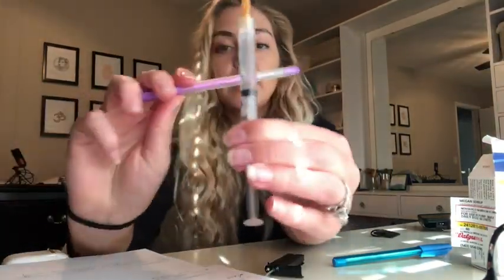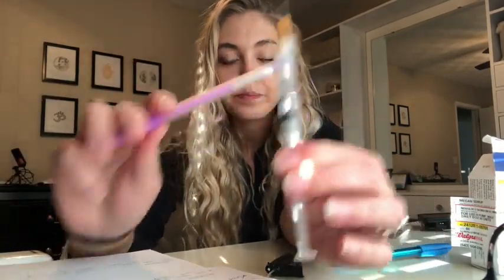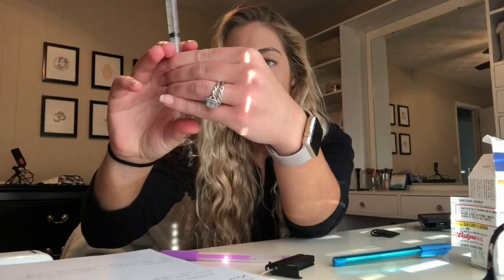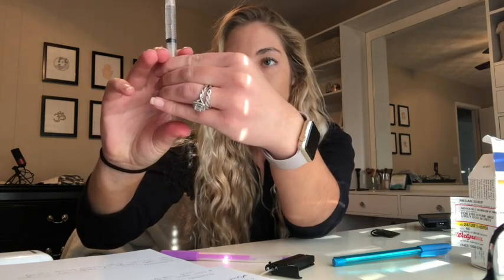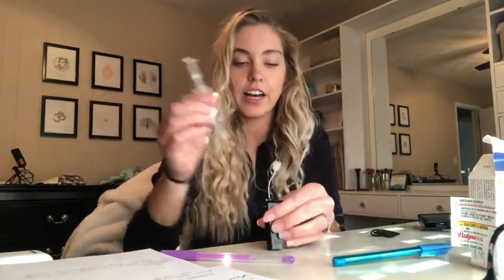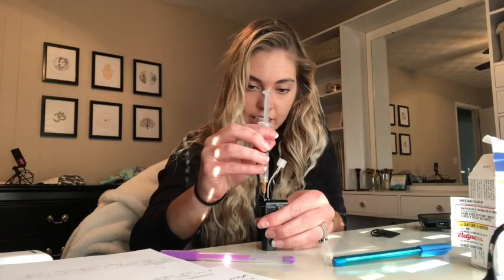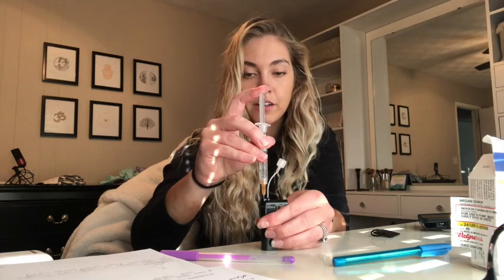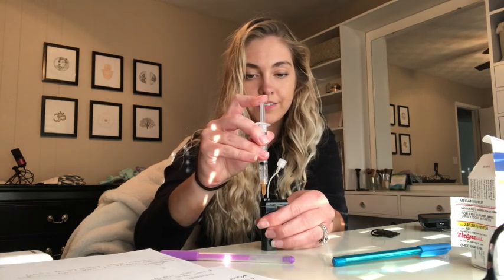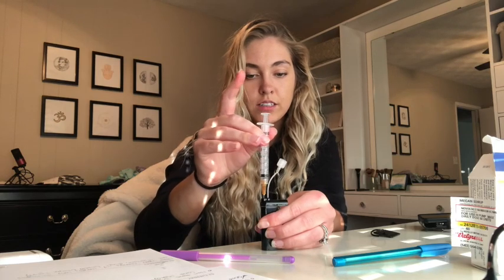Use my pen again to get all the air bubbles up to the top and then push up to get those air bubbles out of the syringe. Okay. So once those are all out, I take the syringe, put it back in that white dot until I feel it stop, and then I push the insulin in. Awesome. And then just pull it out.